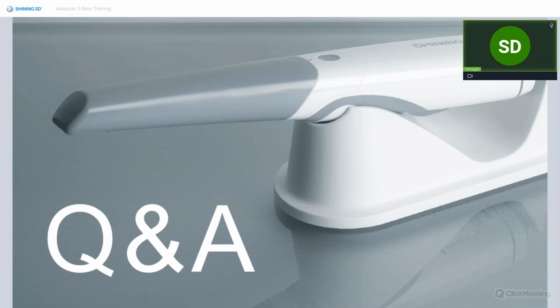Could you export an STL ready to print with the base for other printers, not only for AccuFab? I'm sorry, the answer is no. The models that are ready to print should be processed by our AccuDesign, but data processed by AccuDesign will only have the BB format. That means it's only recognized by our AccuWare.